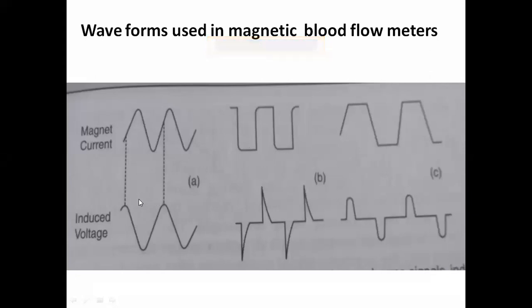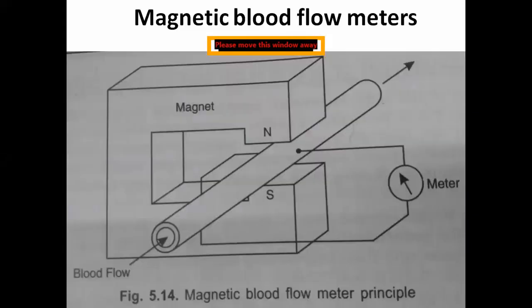Okay, so how much will we receive? The amplitude of the induced voltage at the output depends upon the blood flow velocity.